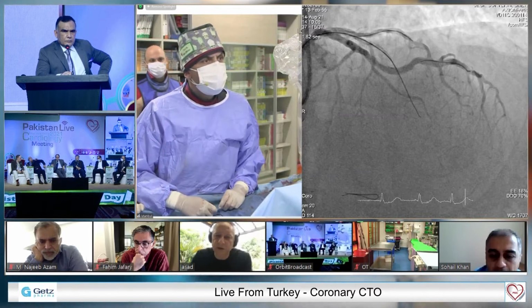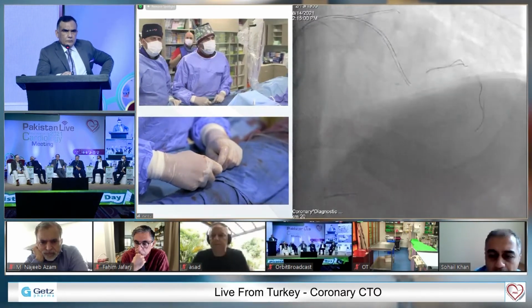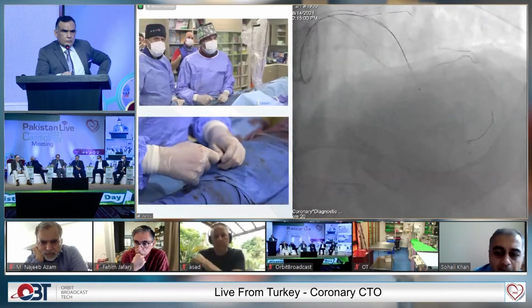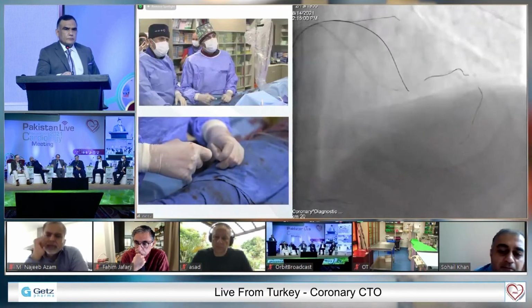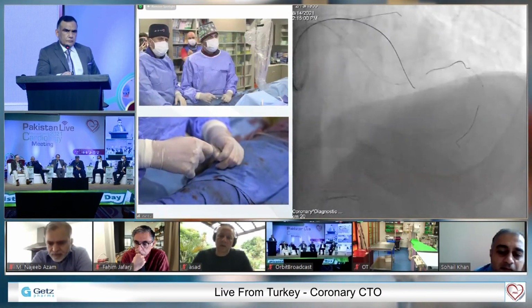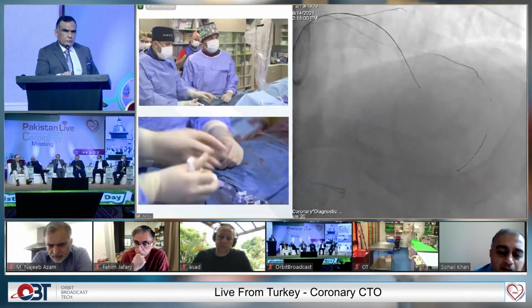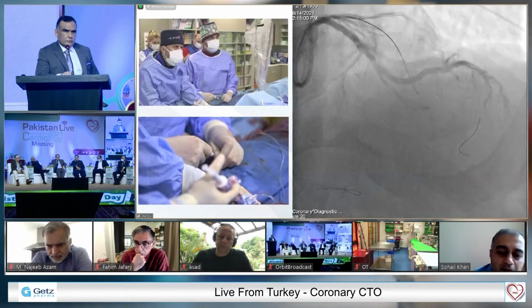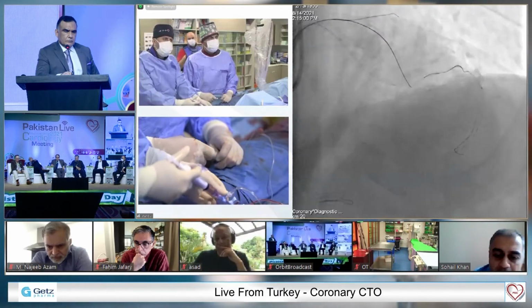Omar, maybe use a microcatheter and do a more selective injection. No. Change the view and see. I think it's higher up than that. Yeah, maybe this one, right? Yes. Let's try. Yes, please. This one. Yes.